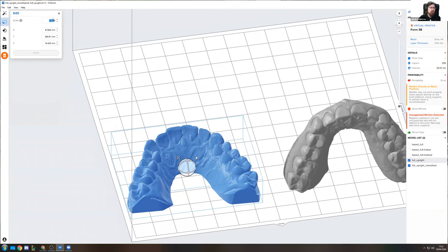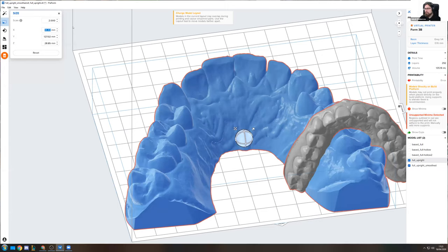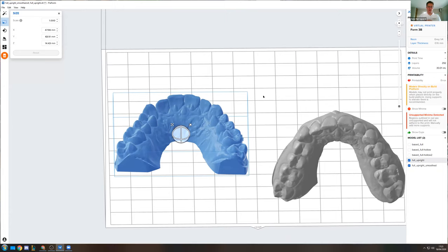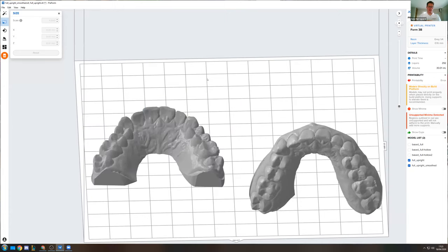And then you can go in here, and 1.0 would be 100% scale. And if you want to, let's say, add 0.1%, you can go in here and scale it up or down by 0.1%. Right now, you don't see really anything happening as it's just 0.1%, but you can even go bigger. But that is actually what will be enough, because then you can troubleshoot if your stock material turns out to be a little bit more tight fitting than others, by going 0.1, 0.5, 0.7, yeah.